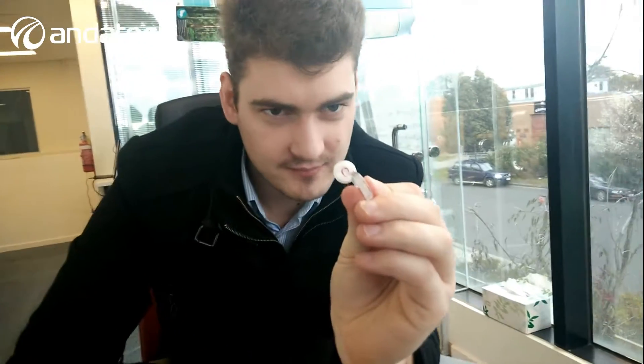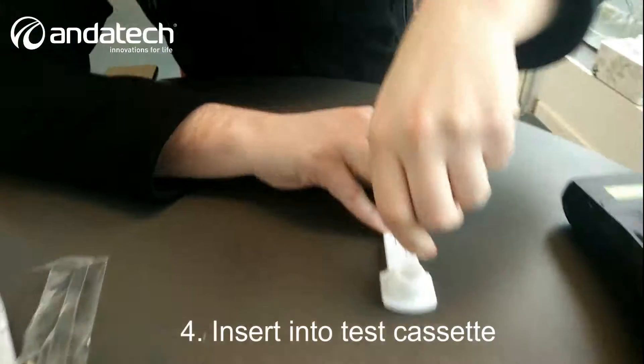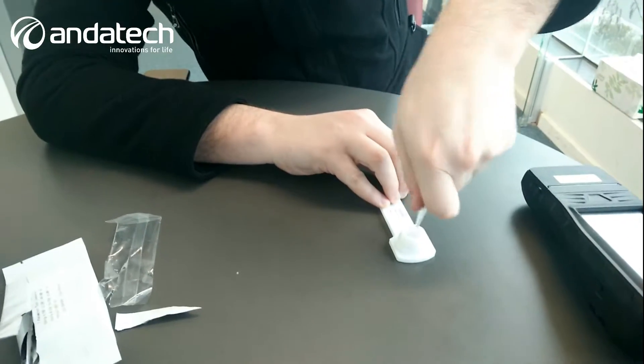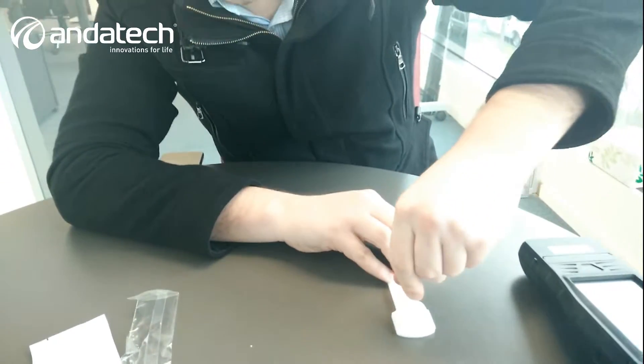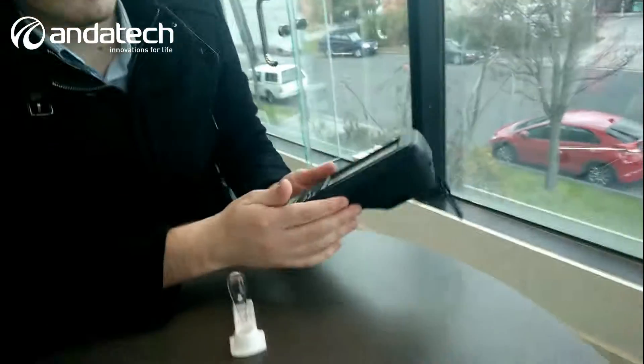I've been soaking on this for about a minute or two. As you can see on the back it's turned red, so it's ready to go. What we do is take it, put it into the cassette, push down on it, and twist — just keep twisting. There we go. Go back to the device.